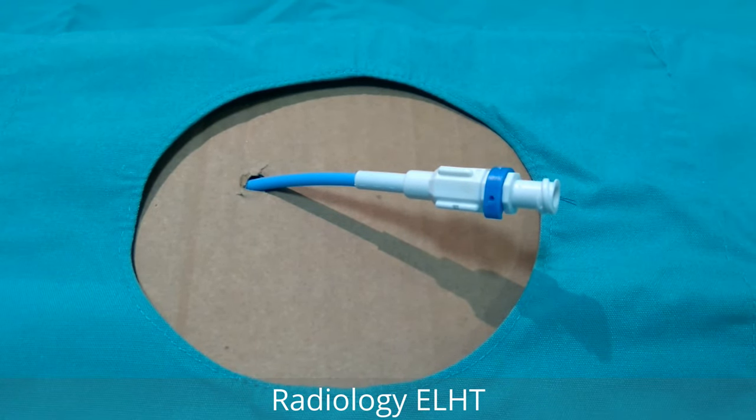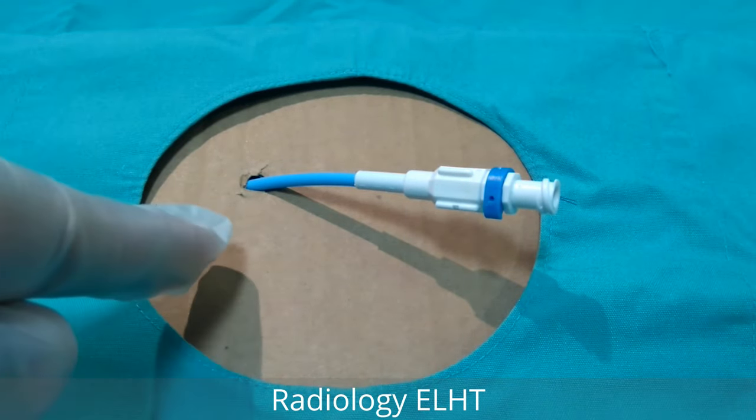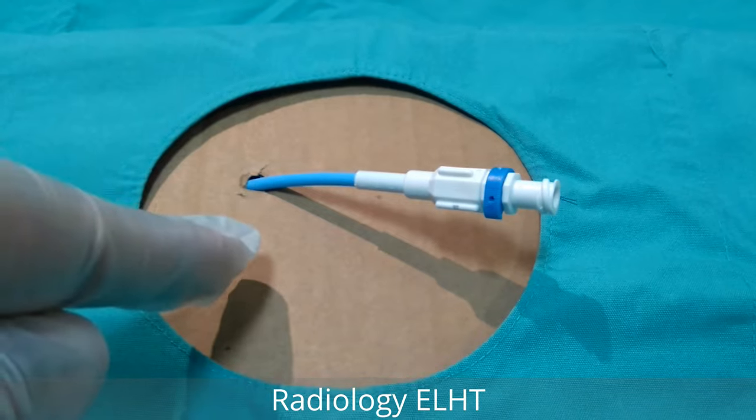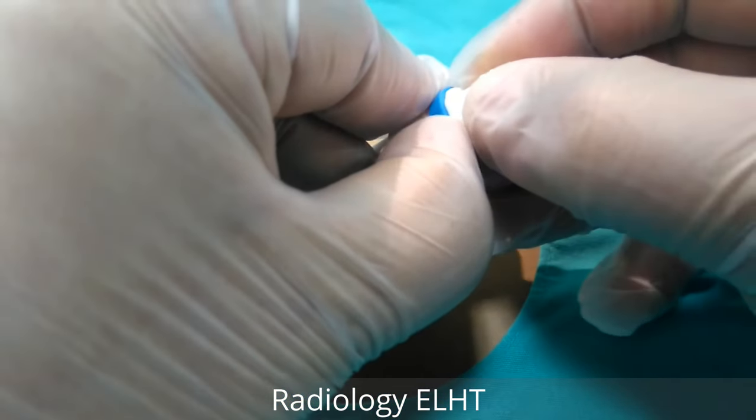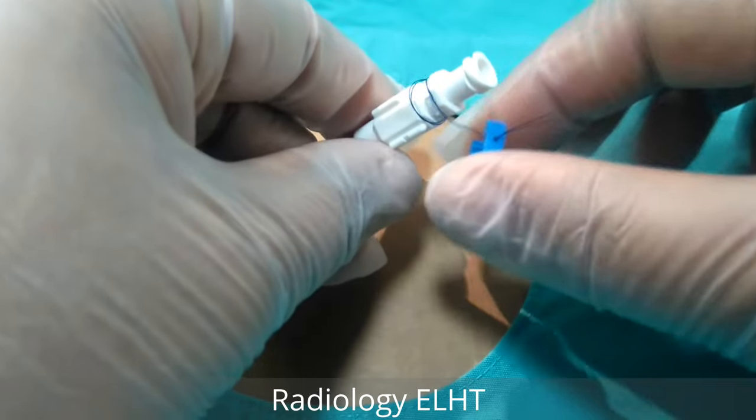How to remove a locking pigtail drain. The pigtail drain is inserted into the patient. There is a small clip at the top — move this clip to begin the removal process.